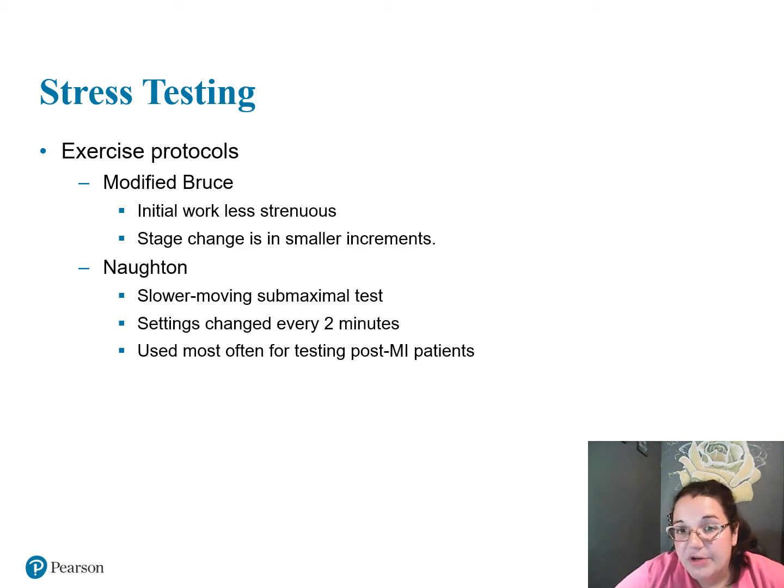The next protocol we have is called your modified Bruce. Its initial work is less strenuous. The stage change is in smaller increments. So let's say maybe I have an older patient, maybe somebody in their late 60s, early 70s. I might not want to give them the most common Bruce maximum test, right? I might want to slow it down just a little bit for them. This would be your modified Bruce. An initial work less strenuous. The stage change is smaller.